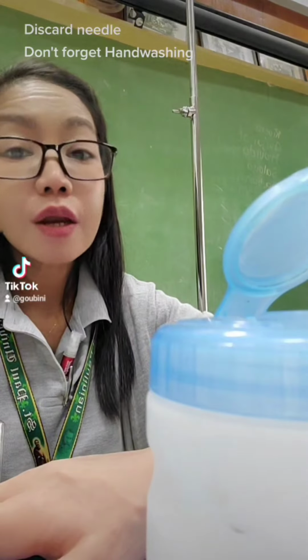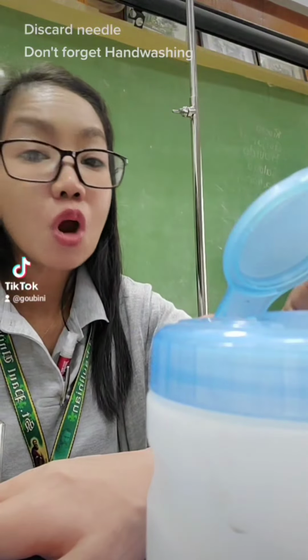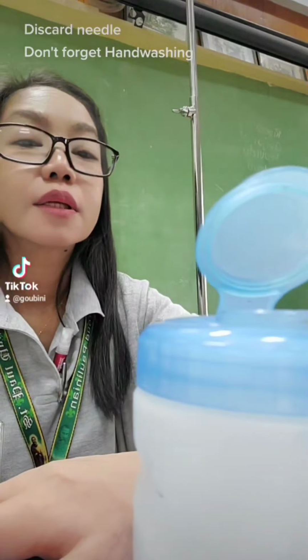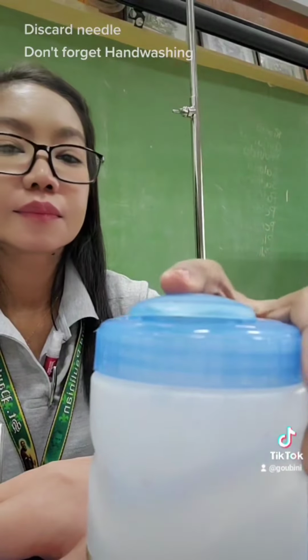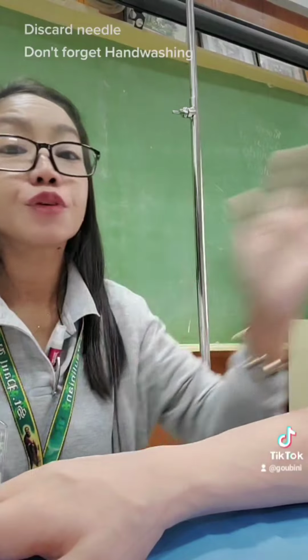For the aftercare, you need to discard your sharp, your needle, in a sharp container. And of course, do not forget to do your hand washing after the procedure.